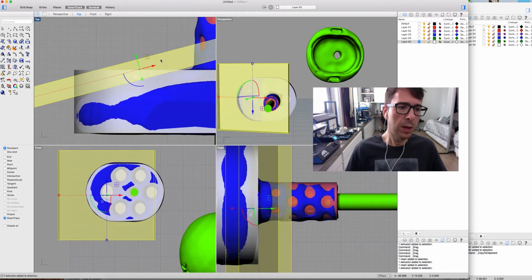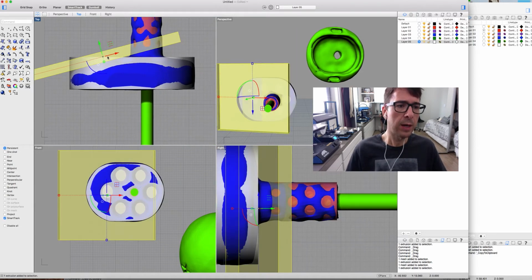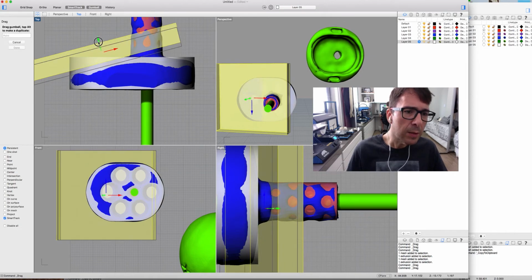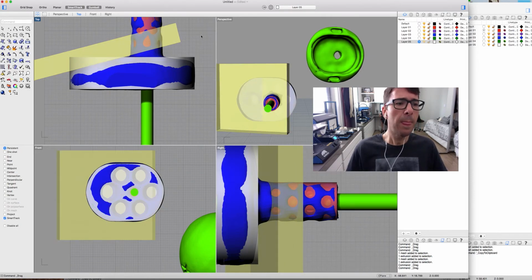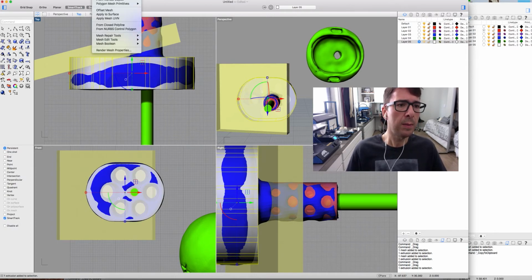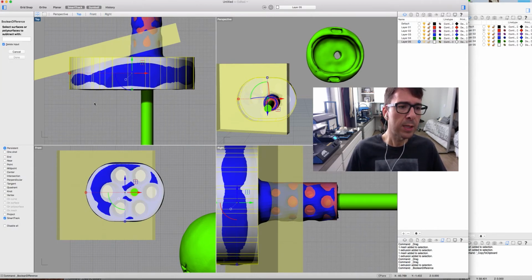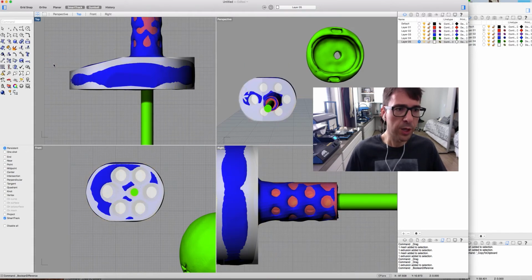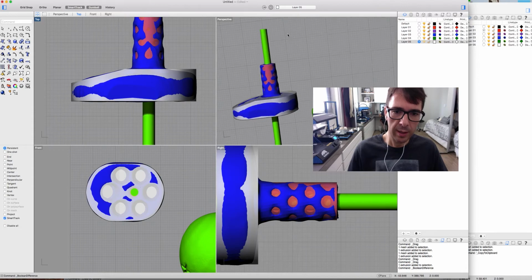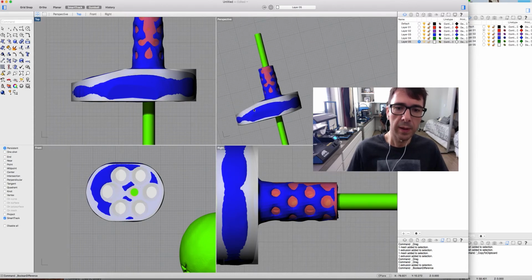Okay, I think we are very good. Let's just move a little bit more like that. Now let's select our implant, solid, difference, and select the cutting object. And now we have here our object, as you can see, with this part cut.